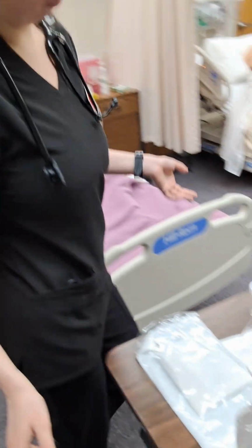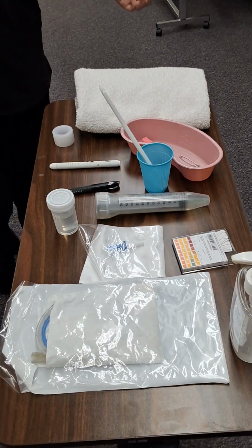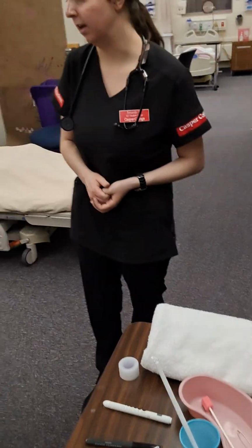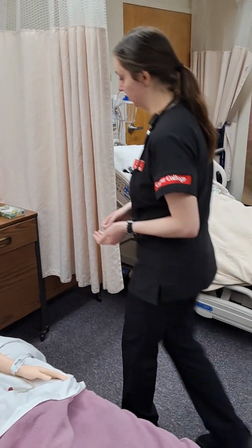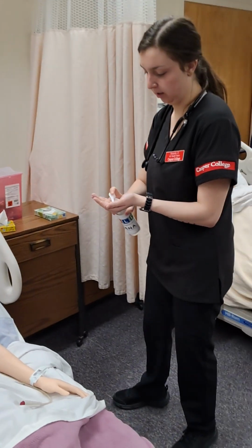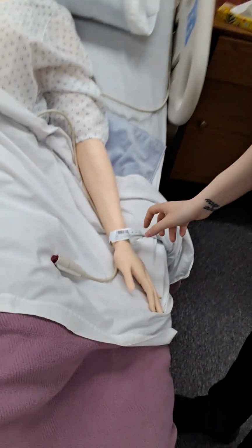So now I am going to gather my supplies. I have all my supplies right here, and now I'm going to introduce myself to the client. Knock, knock. Hi, I'm Amanda. I'm going to be your student nurse for today. I'm going to do my hand hygiene. Can you please tell me your name and your date of birth?